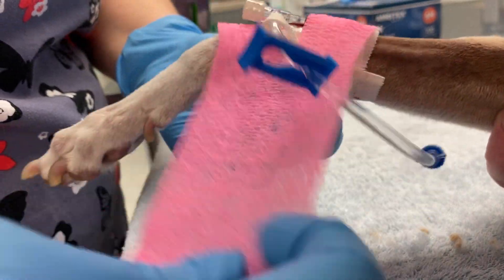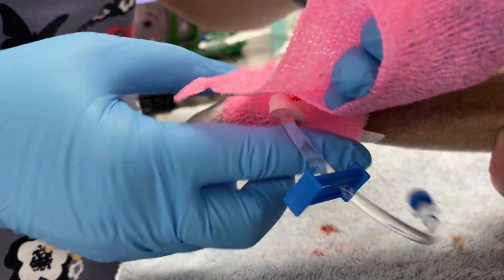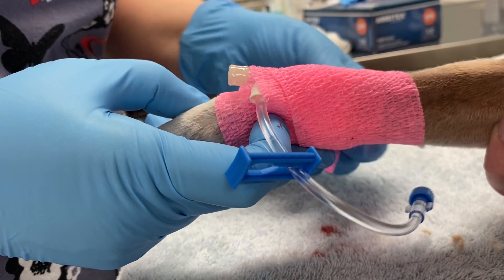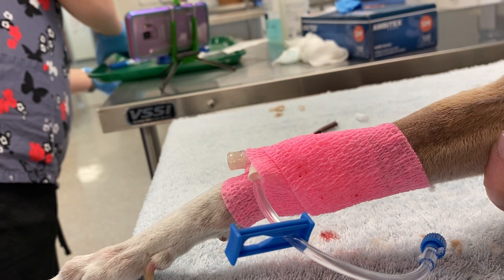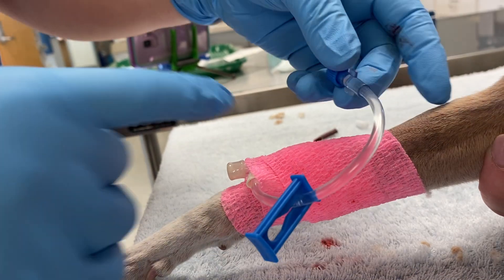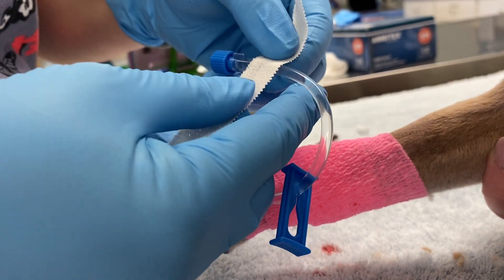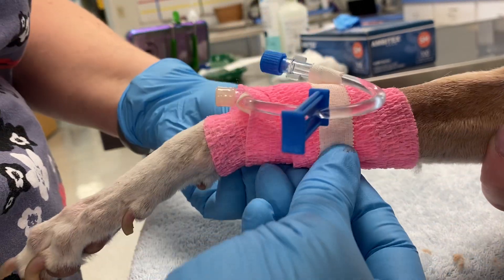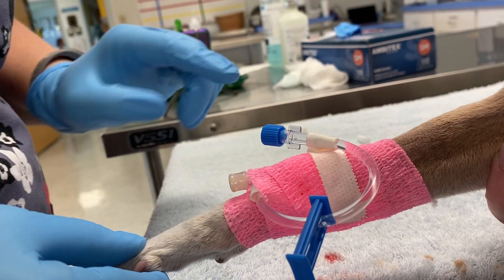Put your vet wrap on — see how it slides right in there. You can use a hole; you don't have to put a slit in it. Just slide it in front of the catheter and then it goes up and over. Notice I'm not putting this super tight — I'm just snugging it down. Once you have your T-port on or your short extension, you want to put a safety loop. Let it fall naturally in its curve so that you're not putting a kink in it. Put your tape over the top, pinch it together, and secure that tape. That helps so if the dog pulls, it's pulling there — not directly on your catheter.